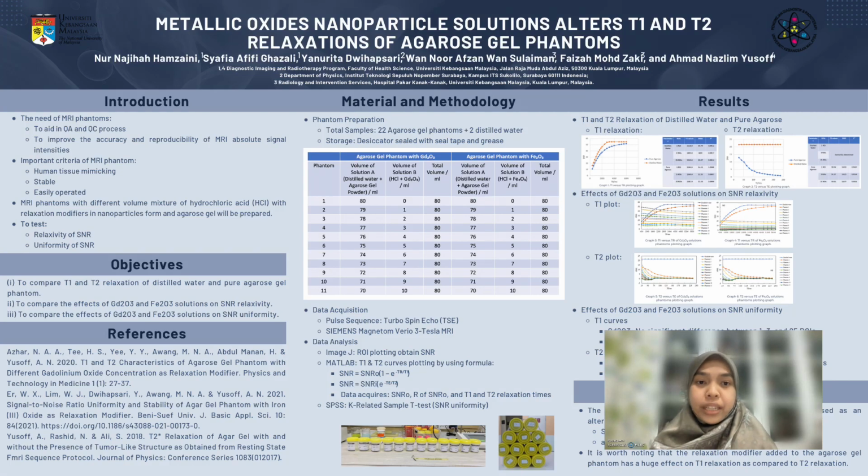Assalamualaikum and hi everyone, I'm Najihah Binti Hamzaini and I will be presenting my final year project, which I entitled Metallic Oxides Nanoparticle Solution which alters T1 and T2 relaxation of Agarose gel phantoms.